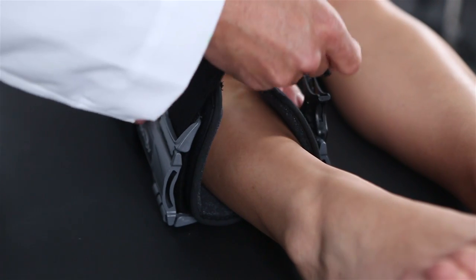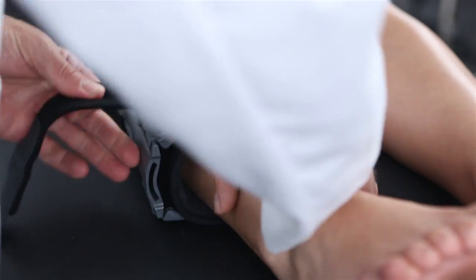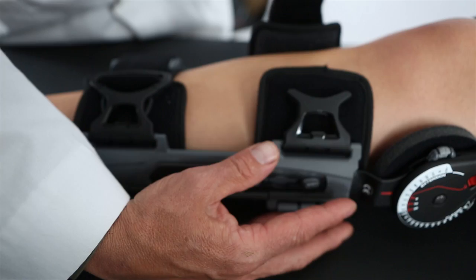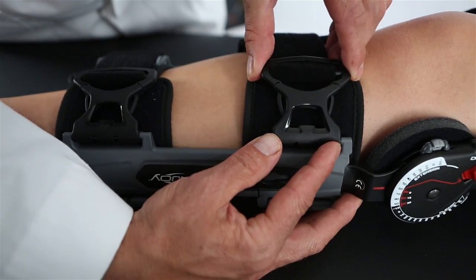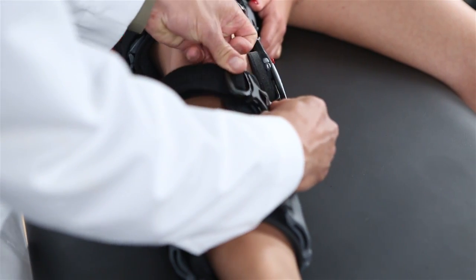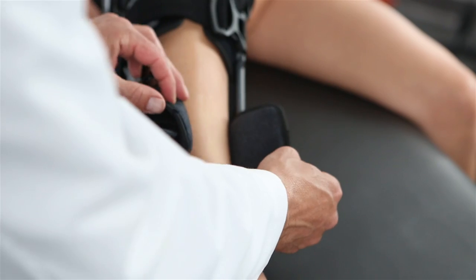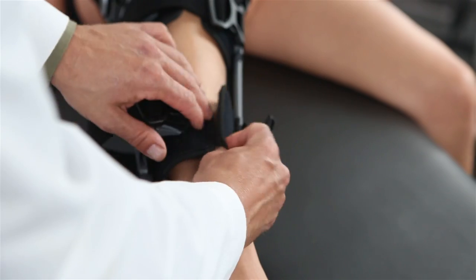The quick-snap buckles attach easily and swivel in place for a quick fit. Start with the upper calf strap and clip each of the black buckles onto the slider. You'll hear a click when it's properly fastened. Next, pull on the loose ends to tighten the straps. The swivel tabs and buckles provide a close fit, while the sticky foam helps keep the brace in place.